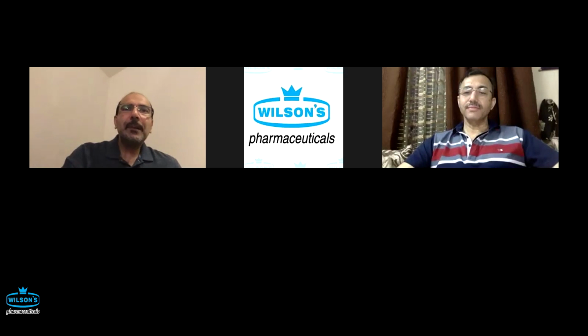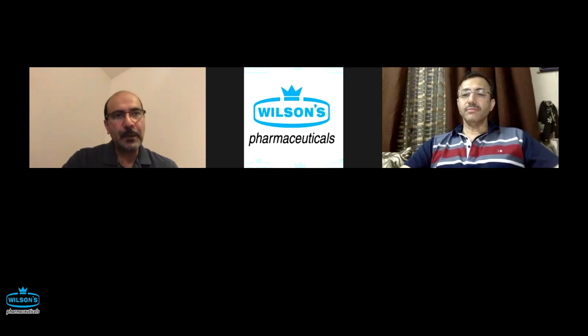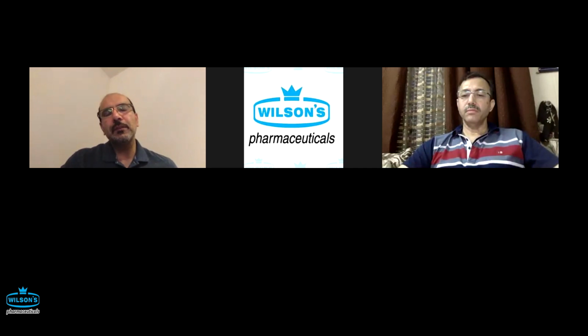So I think part of it is the type of scope you have. Because of my work situation, I have had the fortune of working with both the two main brands, Pentax and Olympus, and what I've noticed is that the Pentax scope tends to want to fall out of D2 into D1 and stomach quicker than the Olympus. I personally like to do both views. My personal approach is I start in the bulb, I do my bulb evaluation, and then I reduce to the second.